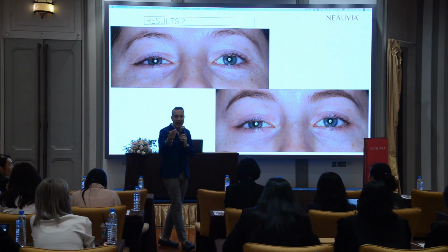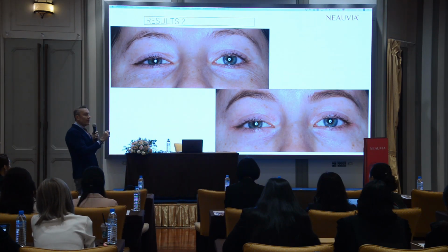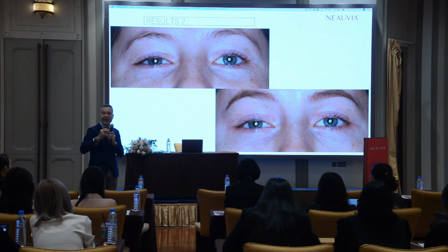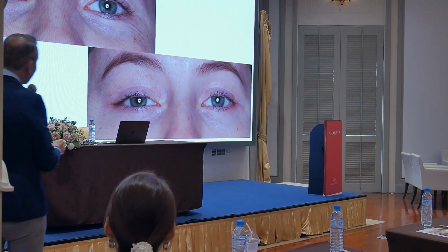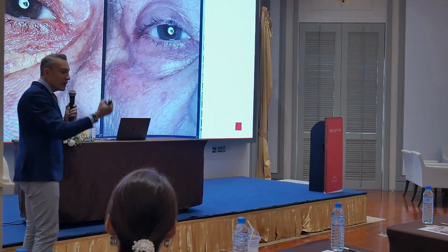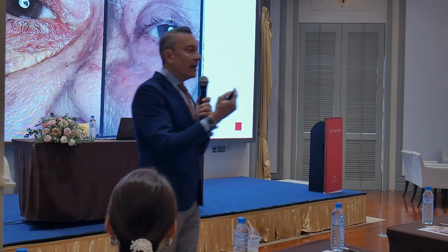So cut, excision, and removal of the tissue. But when the situation is still like the one you see here, you can improve the situation by using the plasma. But at the same time, you can also connect a return electrode, so you can use higher energy, and you can remove the xanthelasma. This is one of the treatments you can perform.